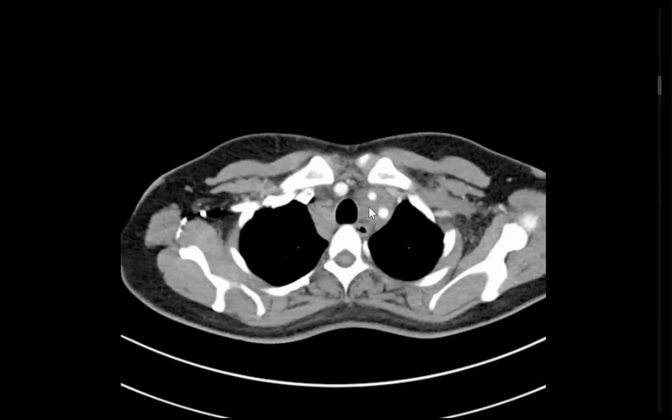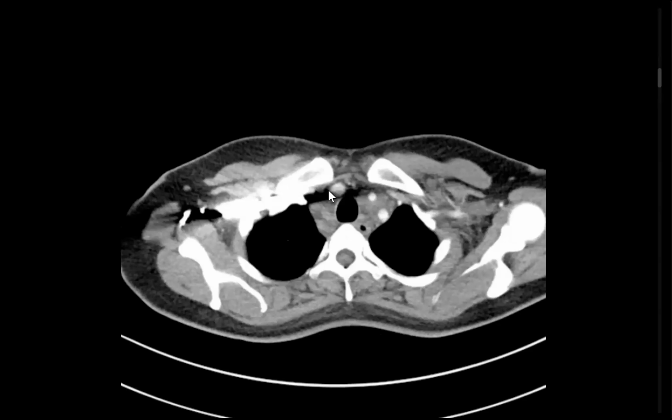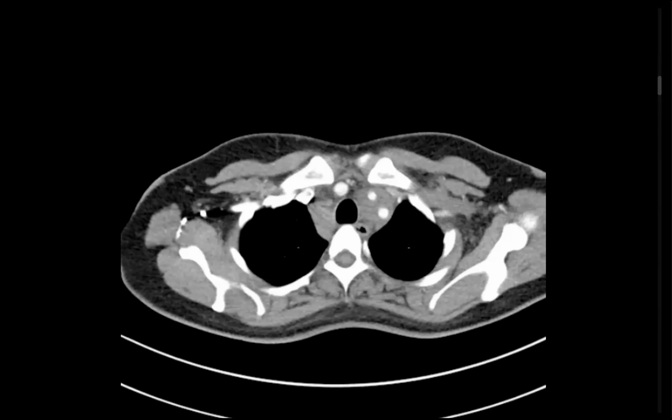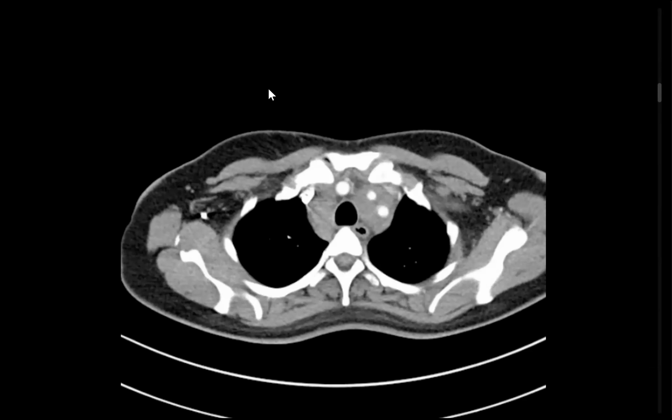When the soft tissue surrounds the vessels without attenuating their caliber, it is called the sign. They like to hear the signs. Soft tissue surrounding the vessels without occluding them: floating vessel sign, correct. Sandwich sign in the abdomen. I am bad in remembering the names of the signs. No problem. Okay. Take care. You and our friends, they like to hear the signs.